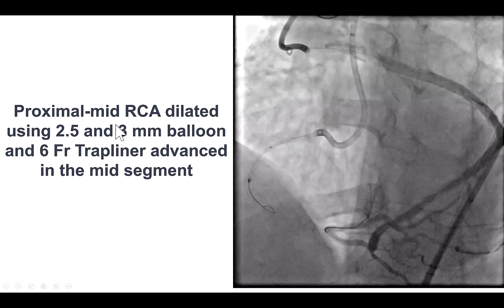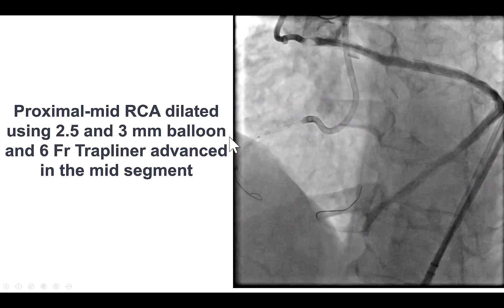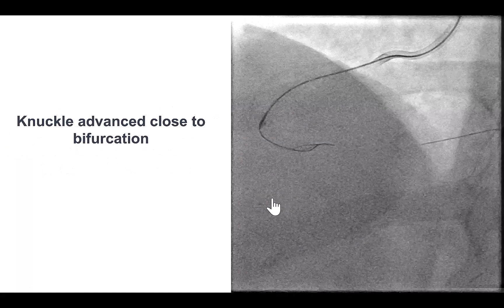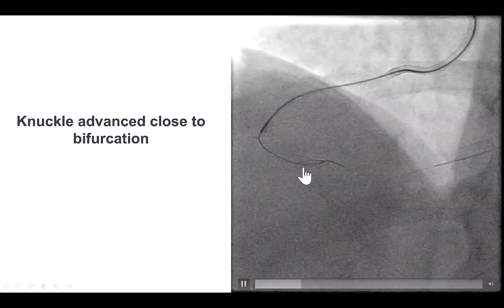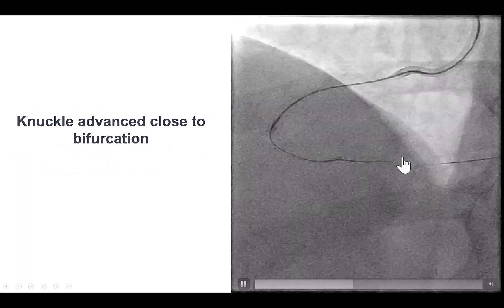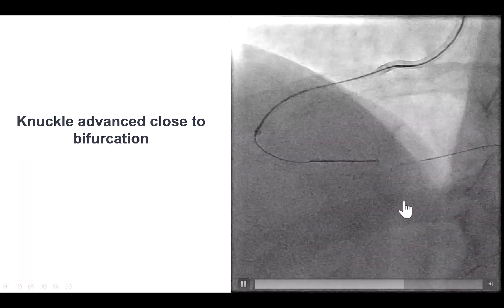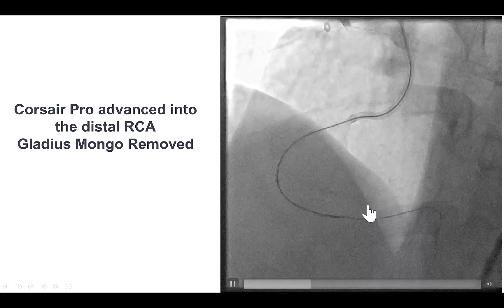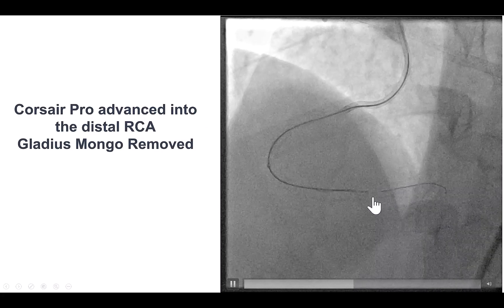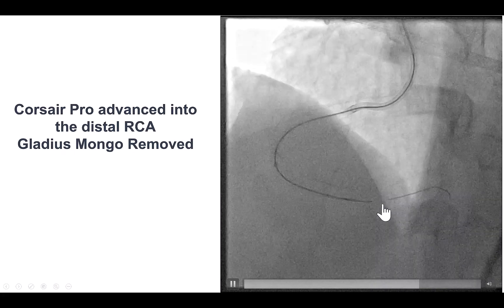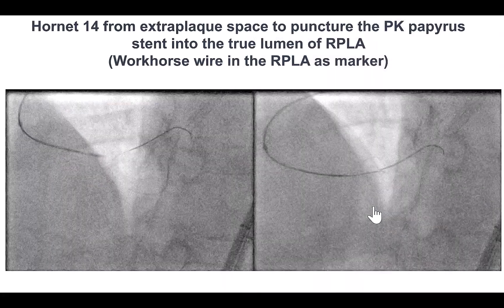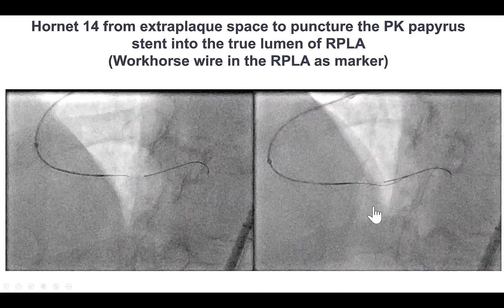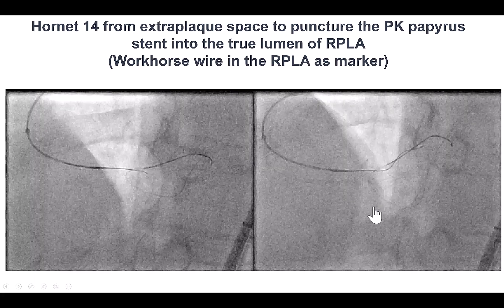We predilated that segment with a balloon and were able to advance the guide extension further down into the right coronary artery. We then knuckled essentially all the way to the PDA-posterolateral bifurcation. Now we were in the situation where we were next to the distal true lumen, but the PK papyrus stent was in the way. Getting through that area was going to require high penetrating power.